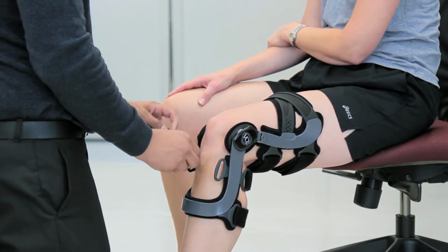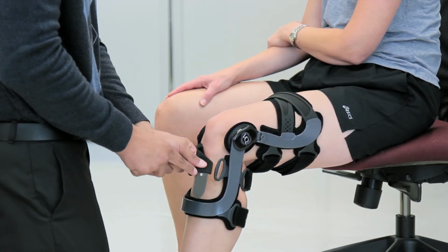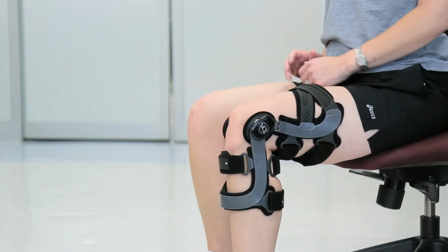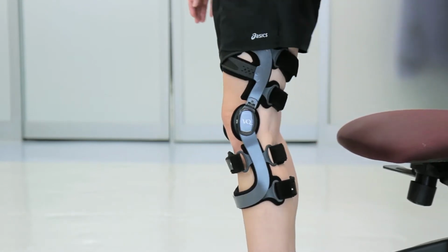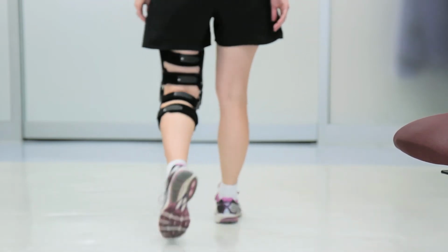Adjust strap number 5 in the front of the brace so that the indentation of the tibial pad sits right on the crest of your shin bone. Do not over-tighten this strap. Stand up and walk around in the brace. Make sure it feels comfortable and that there are no gaps or pressure points. It is normal for the brace to drop slightly to find exact knee center.